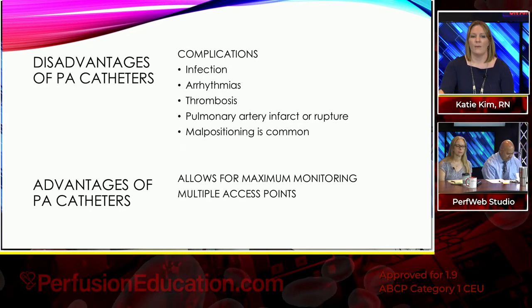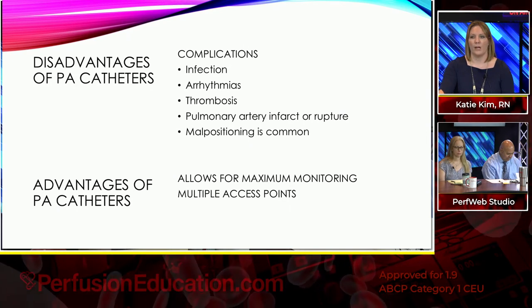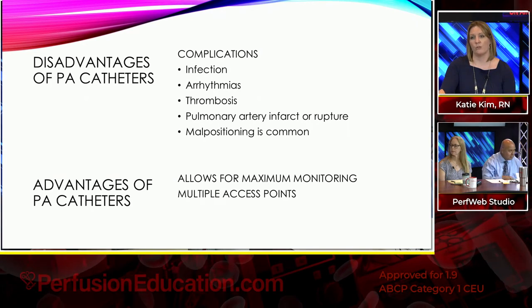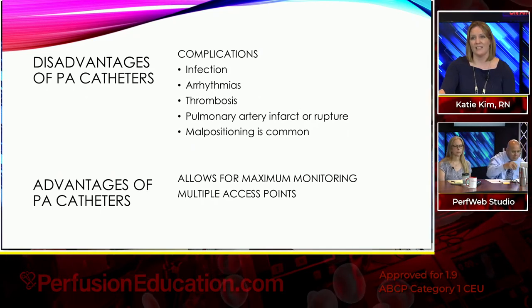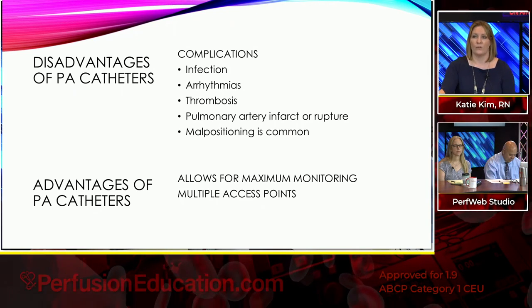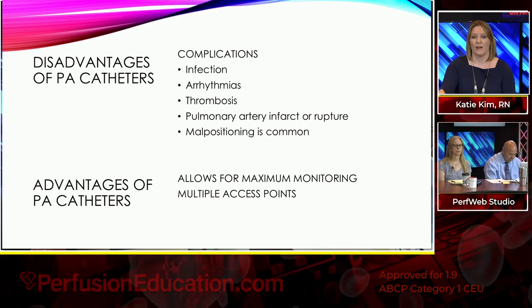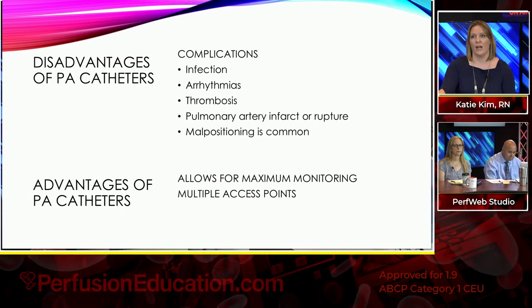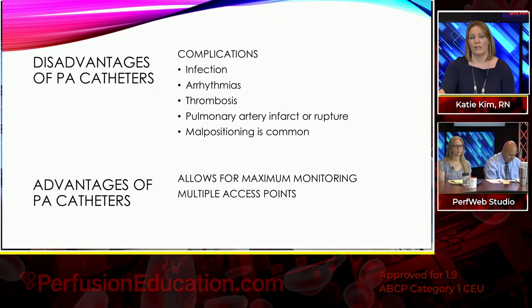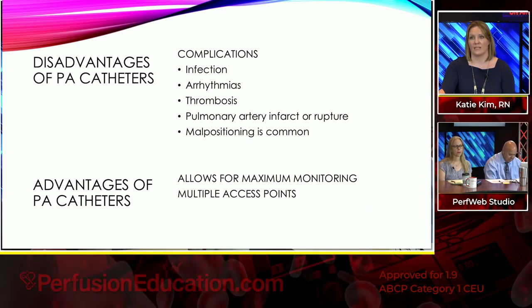And then keeping that pulmonary artery wedge pressure measuring for too long, greater than like 15 seconds, puts you at risk for pulmonary artery infarct. And even worse, if you overinflate that balloon over the 1.5 milliliter range, it can put you at risk for rupturing the pulmonary artery. So those are really bad things to happen.